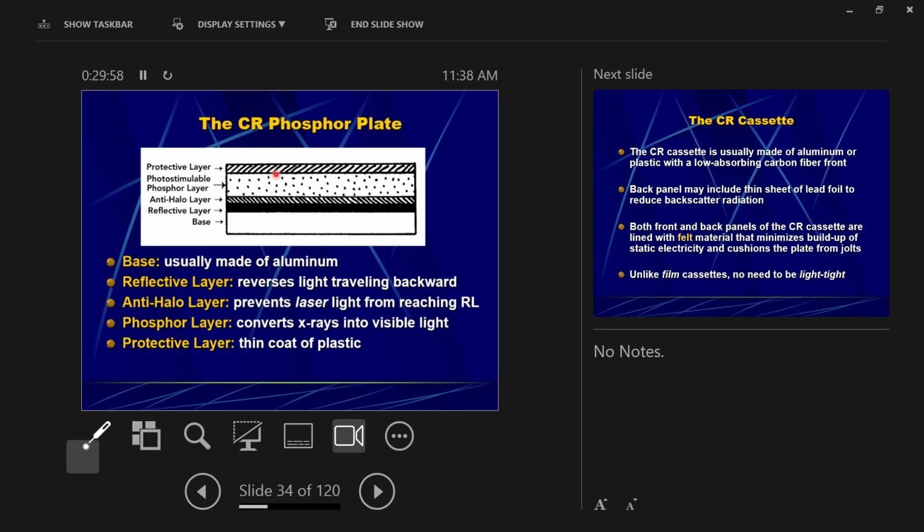Everything on this chunk right here is the layers of this. Okay, it's all held in this thin little thing. These are all very, very thin layers, right? This is labeled backside. I know you can't see it, but it's labeled backside right here. This back is aluminum. Layered on top of the aluminum are all of these layers that we're talking about right now. Okay, only one of them is going to be useful in actually storing information.